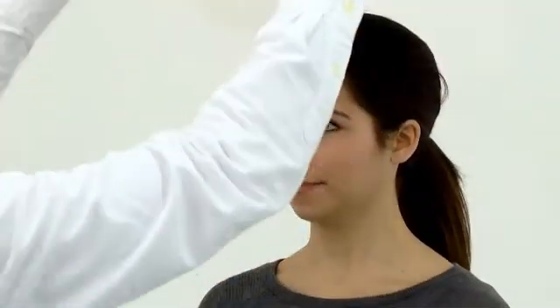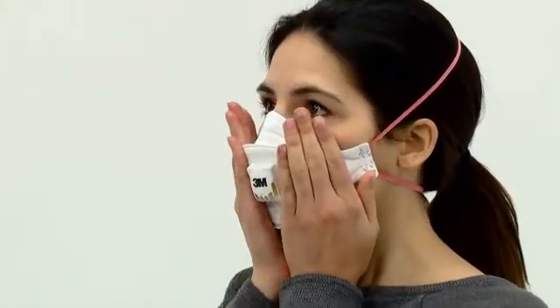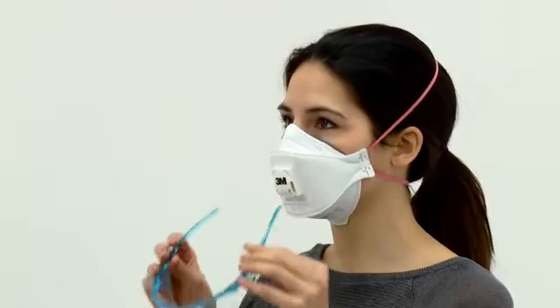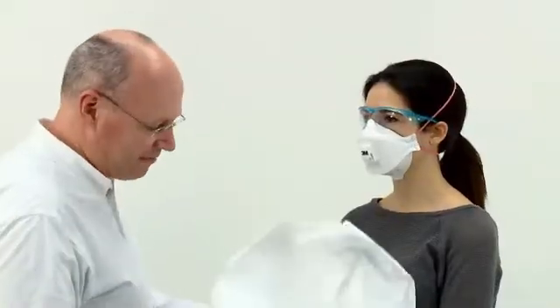Time should be allowed for the taste to clear from the wearer's mouth before starting the fit test. Rinsing with water may speed this up. The subject should also wipe their lips to remove any residual sensitivity solution. Explain the test and the 7 exercises to be performed. These exercises are designed to simulate some of the stresses the face seal experiences during the working day. After confirming the taste is cleared, ask the subject to fit their respirator and perform a fit check. They should also wear any other personal protective equipment or glasses that would be used with the respirator and might affect its fit. Ask the test subject to tell you if they taste the mist at any time.